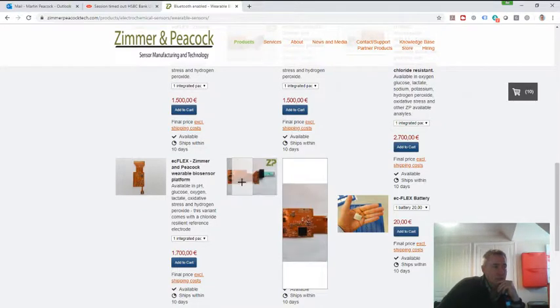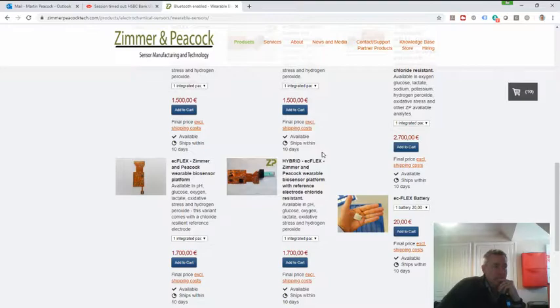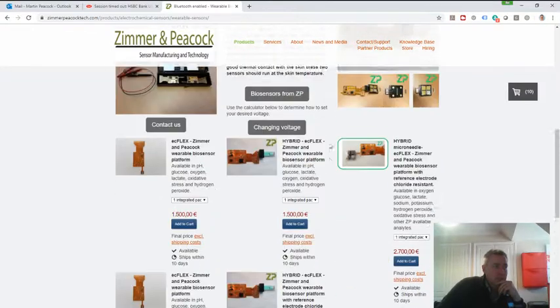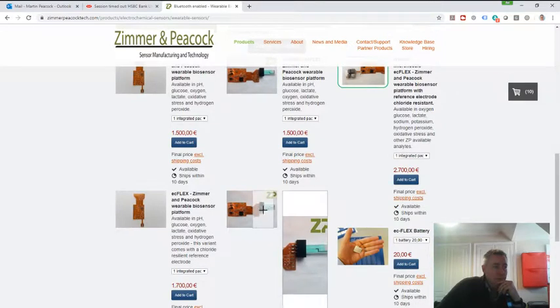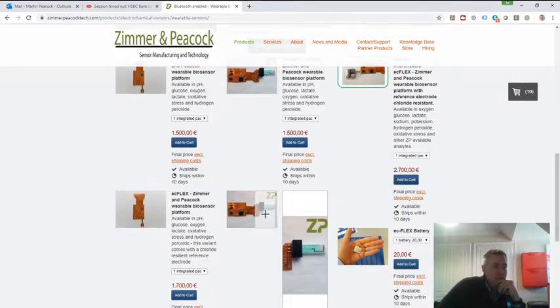Tell us when you're ordering it that you want it for glucose. So you'll get this electronics and then you'll say I want it for glucose. My suggestion then is you buy it in the hybrid version. So that basically allows you to click in different sensors.